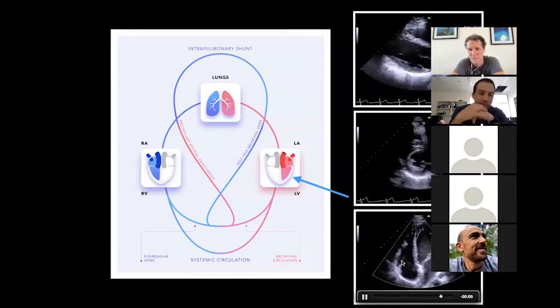Yeah, certainly. So just from the B mode imaging, I can get fractional area change. I can get systolic and diastolic measurements. I can get TAPSE, I can get an S prime. If I've got good enough image quality, I can get some strain imaging off the RV free wall as well.